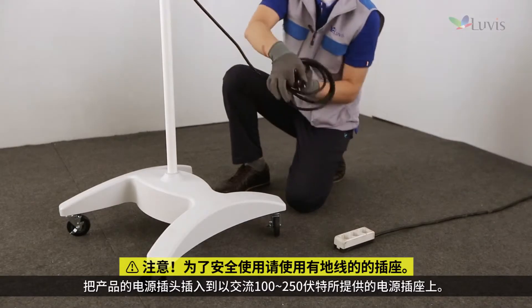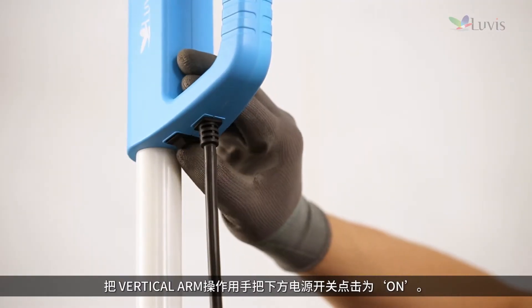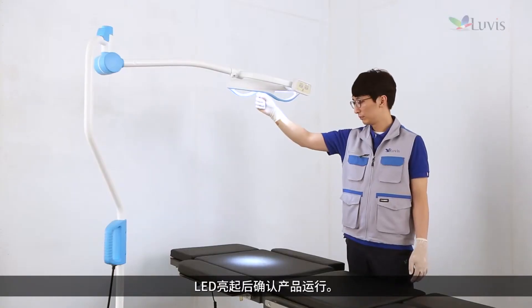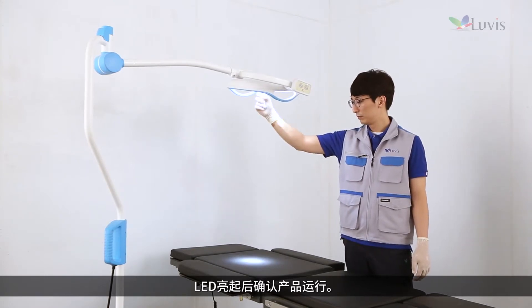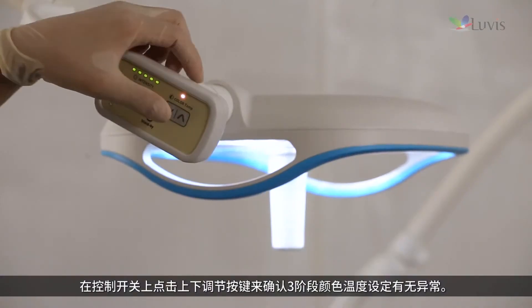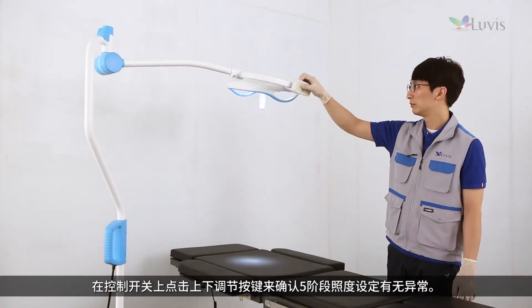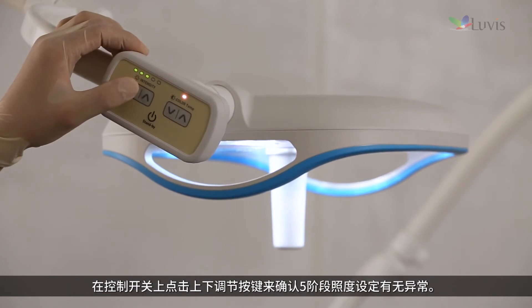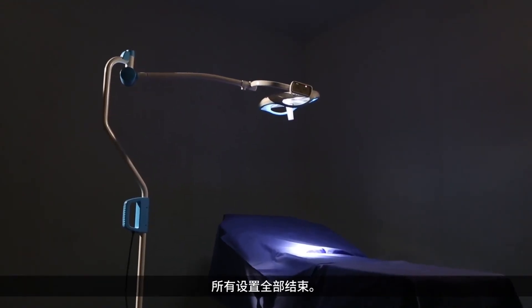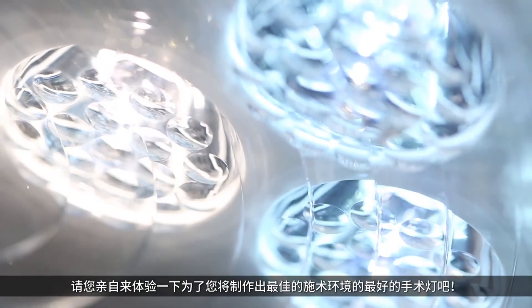Check that the power switch below the vertical arm control handle is off. Plug the product power cord into an AC 100–250V outlet. Press the power switch on. Press the standby switch from the head assembly's control switch. If the LED light is on, check the product operation: inspect any problems with the inspection pattern while turning the focus control knob, check three-step color temperature settings and five-step illumination settings using the up/down control button. Installation is now complete.